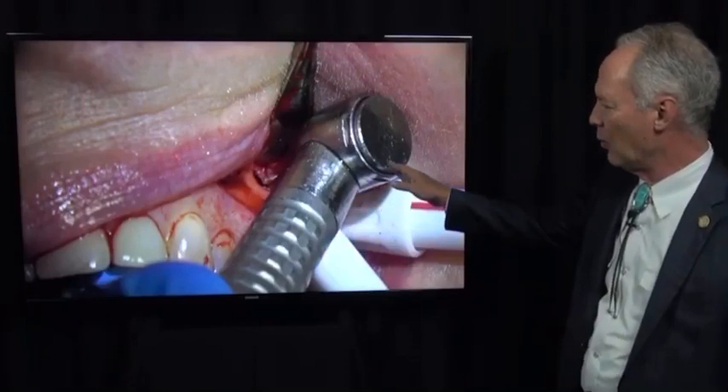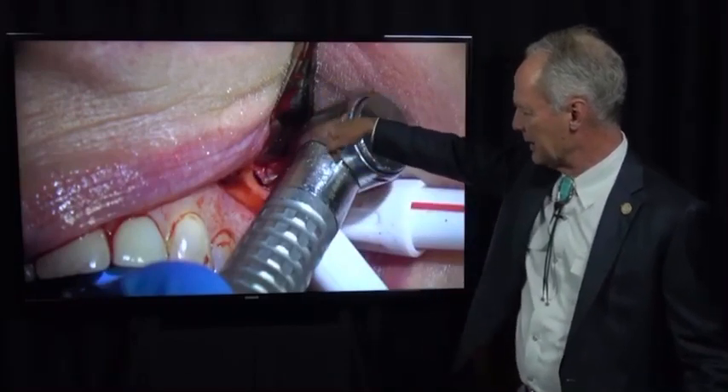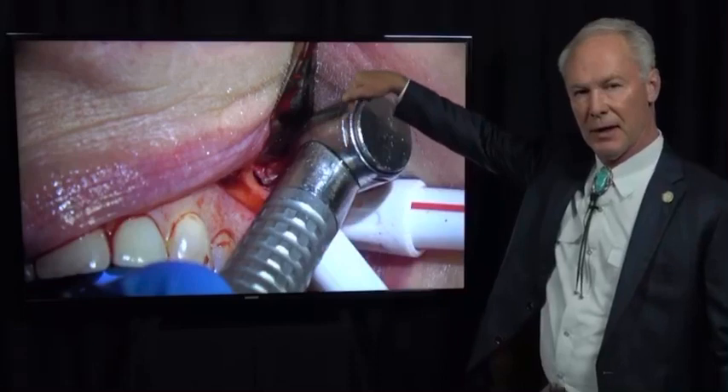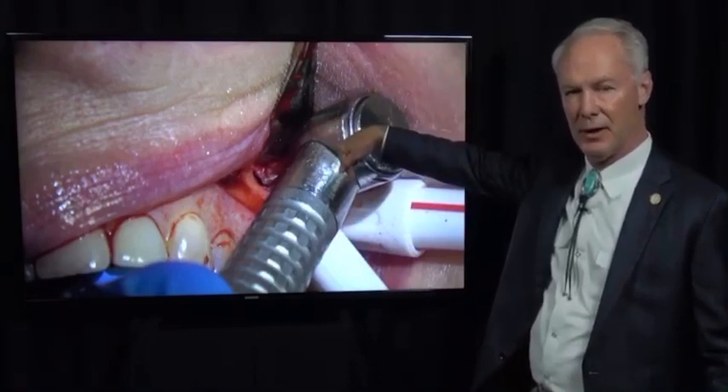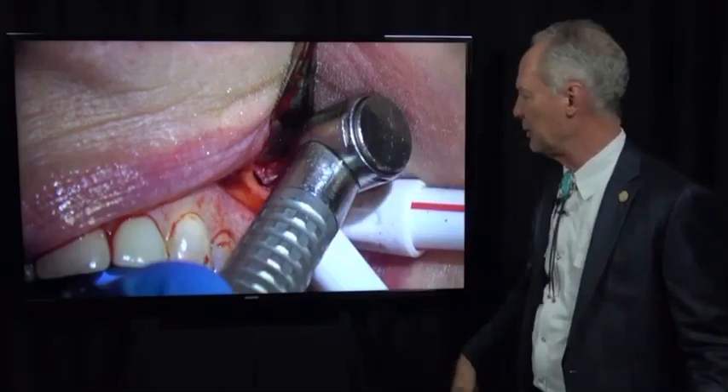This is about a number one round burr to make a slight divot in the tip of that apical part of the root, and that's where you're going to retrofill it — where we're going to place the retrofill.